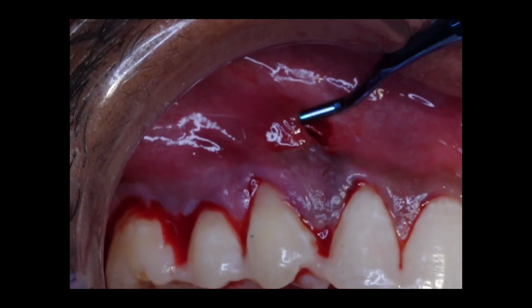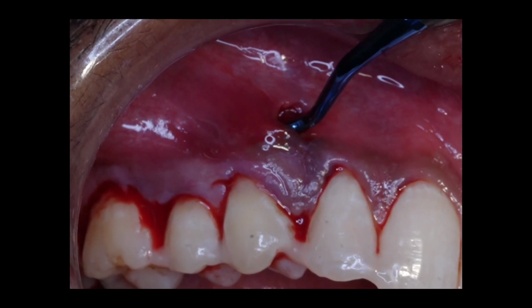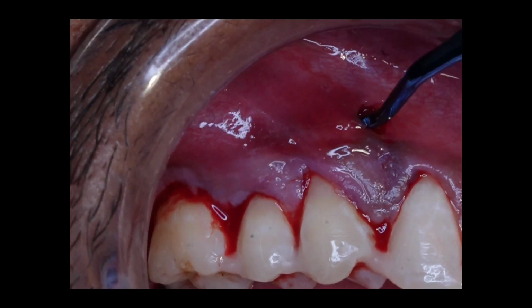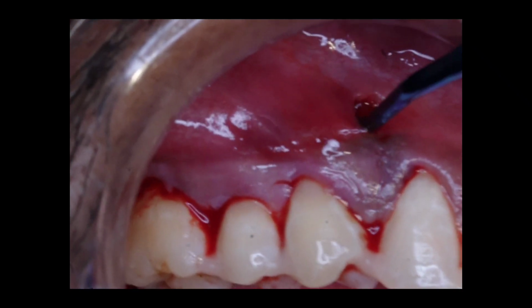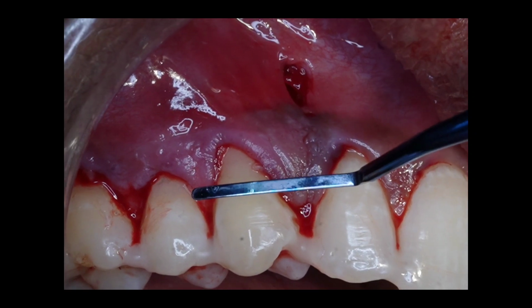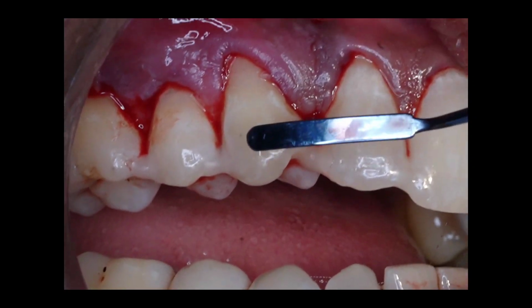using the vestibular incision. So, insertion of the next VISTA instrument into the tunnel and releasing the fibers, full thickness coronally and partial thickness apical to the mucogingival junction. The next instrument, a sharp one, double-ended. This is the other end.